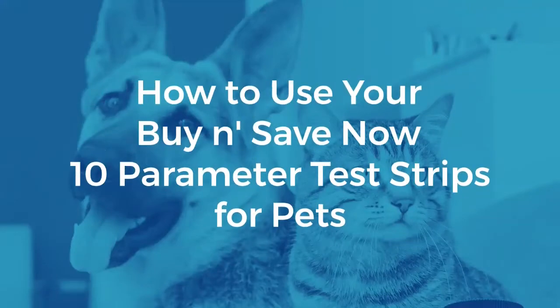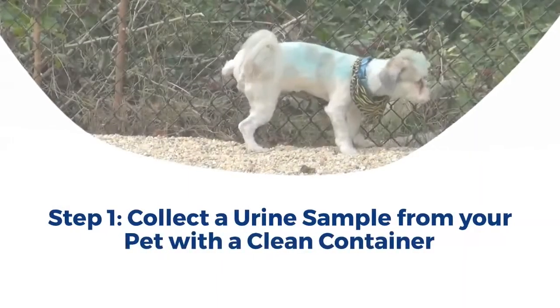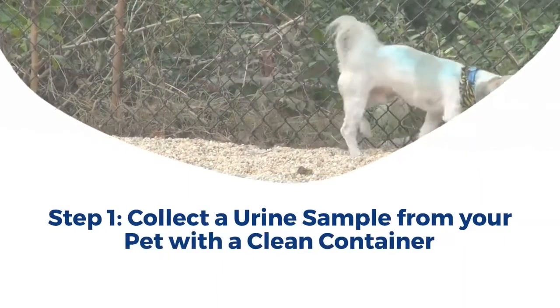How to use your Buy 'n Save Now 10 parameter test strips for pets. Step 1: Collect a urine sample from your pet with a clean container.